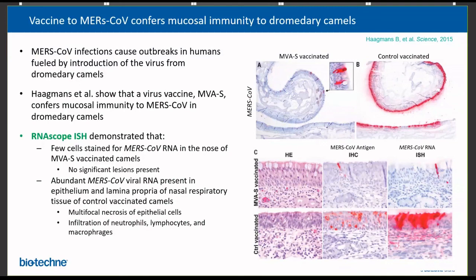Now, this was an old paper when MERS had happened. So if this was a recent time, you could use, again, the dual ISH-IHC workflow that Mladen talked about to look at this data on single tissue and in the same tissue context.